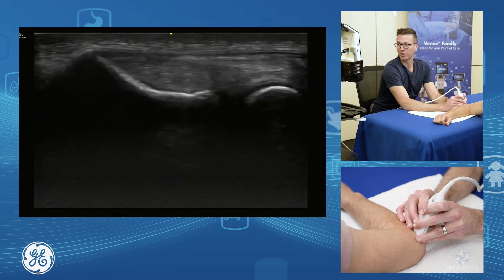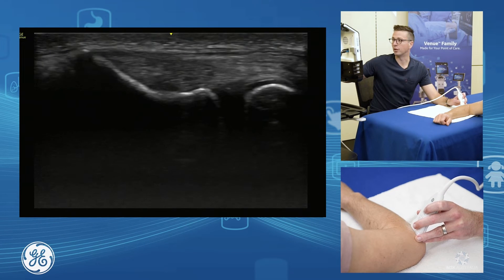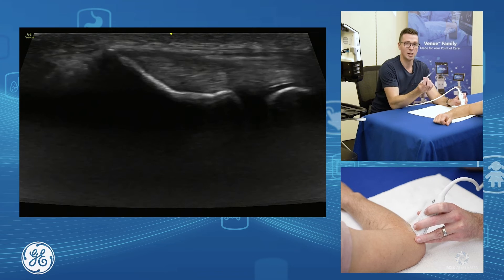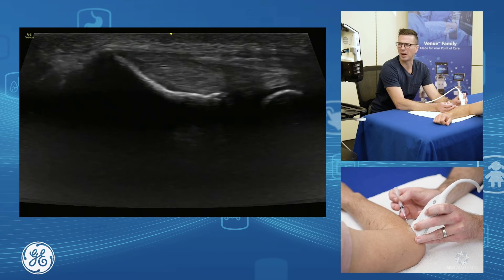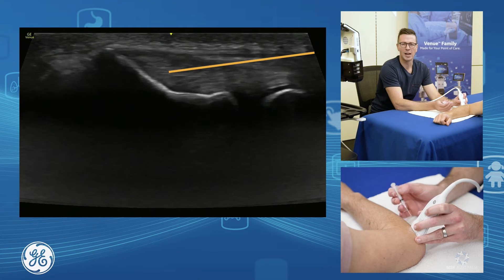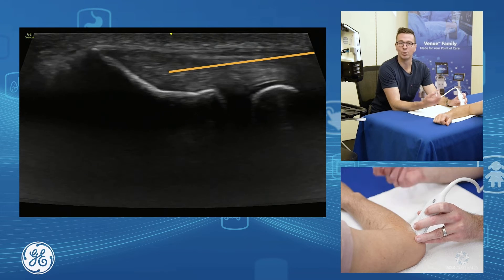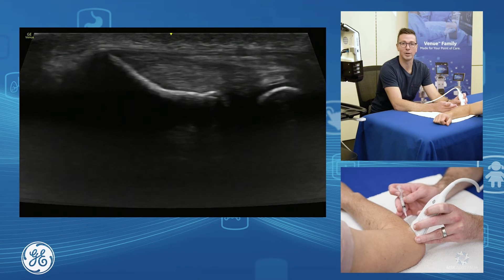For injection therapy of our common extensor, probably the nicest way to do it is in longitudinal. I'd use a virtual convex appearance and bring myself across, bringing the needle in from a lateral approach, starting back about a centimetre and quite flat, then bring your needle in down and underneath. You can do dry needling, intratendinous injections, or a peritendinous injection — whatever you're trying to treat. This is the nice way of injecting our common extensor.